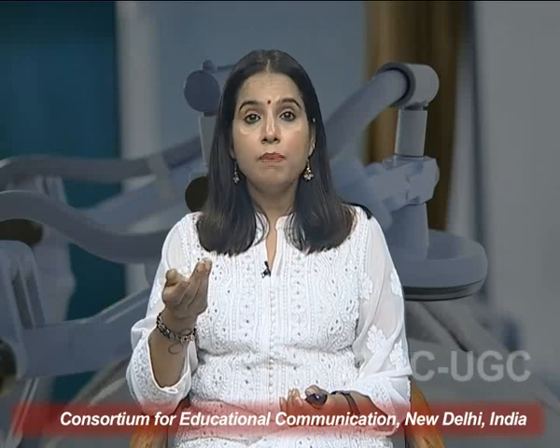However, there is still not a lot of evidence to prove that diathermy is the most effective treatment for these conditions. What are the risks of diathermy? So, the electromagnetic energy used in shortwave and microwave diathermy can cause extreme heat in metal devices such as bone pins, dental fillings, metal surfaces. This could cause burns in the tissue near the implants. So, the procedure should not be used over these areas to avoid the risk of burning.